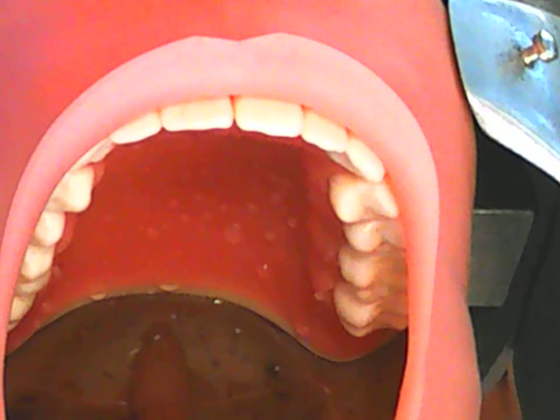If they have not had it before, you definitely want to provide the rationale for using the dental dam: it keeps the area dry and prevents debris from falling down their throat. Ensure client comfort by telling your patient, don't worry, you'll be able to breathe through your nose and still swallow little bits at a time, as normally. If you have any trouble at all, just put up your hand and we'll try to facilitate you.